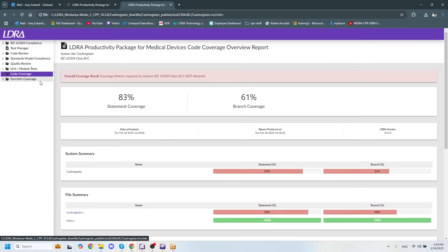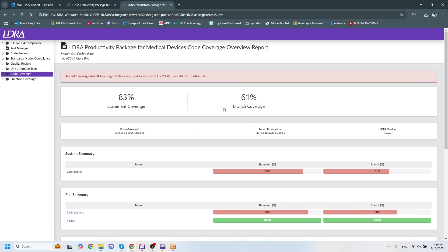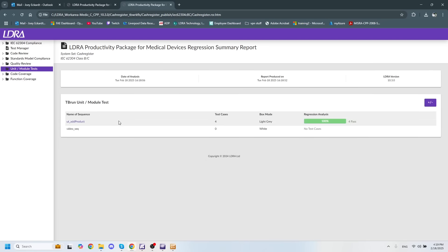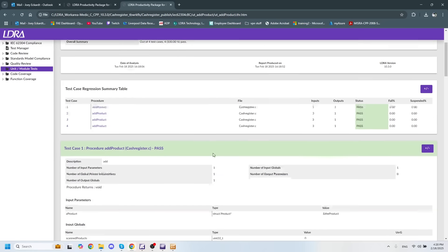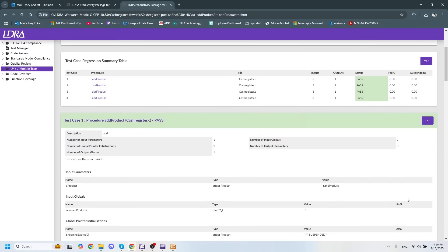We have a code coverage report, which shows us specifically statement and branch decision coverage, as well as a unit and module tests report to show us our different unit tests and whether or not they have passed.